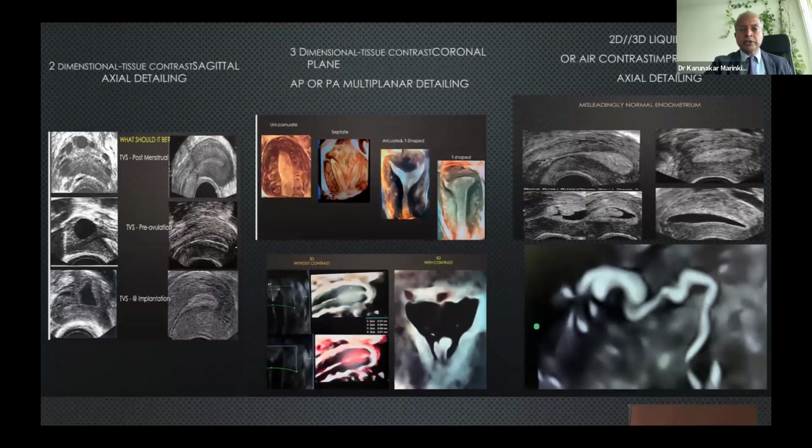I always take this all over the world where I'm scanning, whether I do mock embryo transfer teaching on specimens, or even carry a hysteroscope to show how I perform ultrasound-guided hysteroscopy to minimize perforation. There is an ultrasound machine wherever I go, almost like a laptop, portable, standalone, and now handheld. With the Clarius company, you just use the TV probe with your smartphone, and you can complete a TVS assessment, as well as an abdominal 3D ultrasound of the fetal profile.